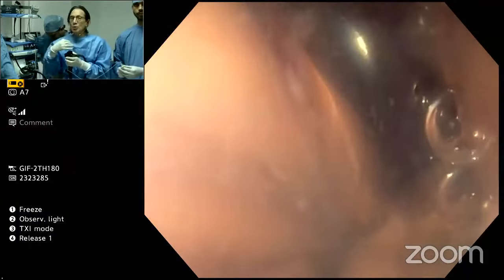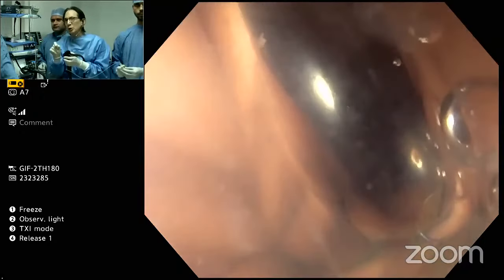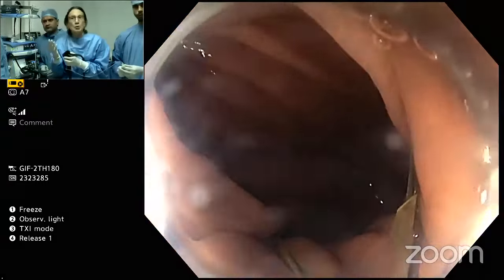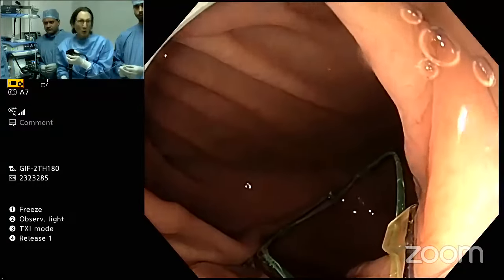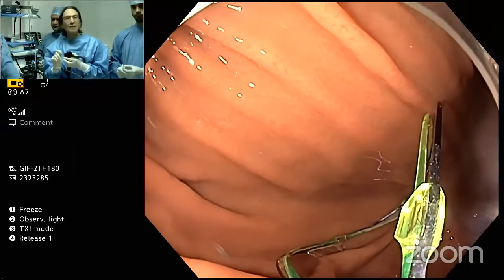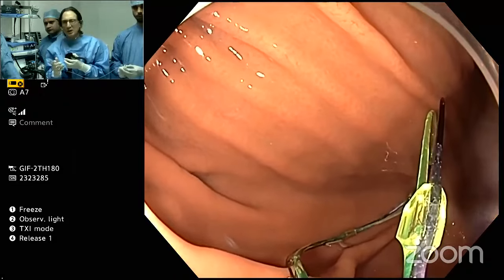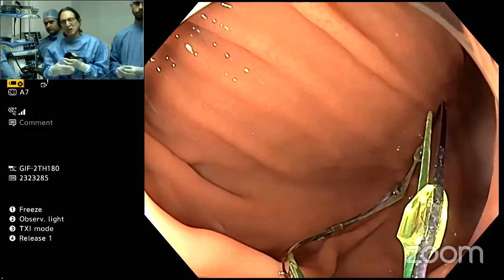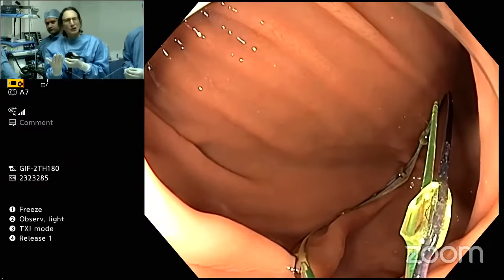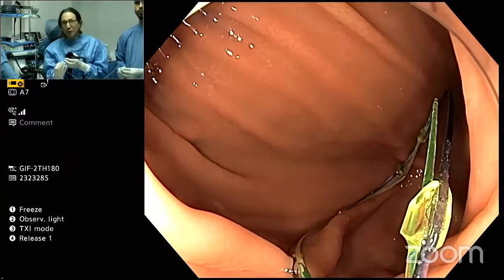So that's the reason why I personally abandoned the idea of stiffening a loop with an inner wire. But it's a wonderful idea. I just don't know whether it's actually something that'll work. But these are exactly the kinds of ideas that I want everyone in the audience to be thinking about when you're doing these procedures. When you do a procedure and you have this loop that's flopping around, think about, well, how can we make this loop better? How can we make it easier? How can we make it safer for the patient?